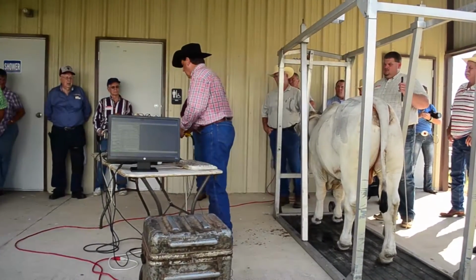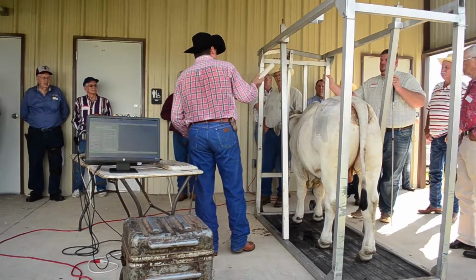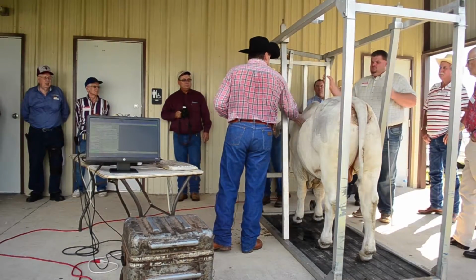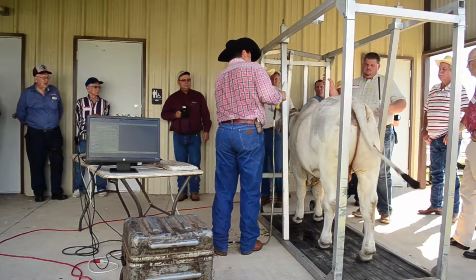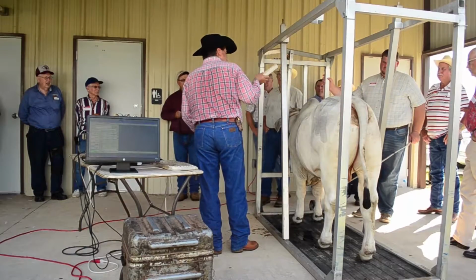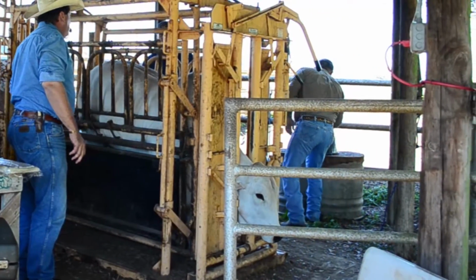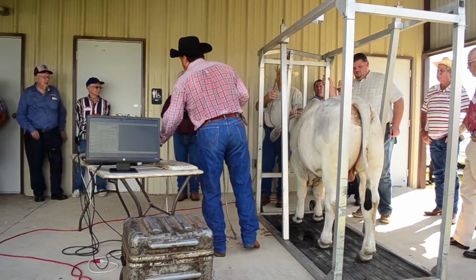Specifically with Brahman cattle, with the shorter back, the hump, and the shoulders, and the length of this probe, it is really best when you're getting marbling images to keep their heads down. When one gets his head up and they start breaking behind the shoulders, in this image you don't get as good a surface area, and it has to be equal pretty much from one end to the other. So that's one thing I've made a habit whenever I get to Brahman places, to make sure that when we're doing this, it might take a little bit more time, but at least keep their heads down, or at least level. Don't let them get their heads up like that, because it will kill your marbling.